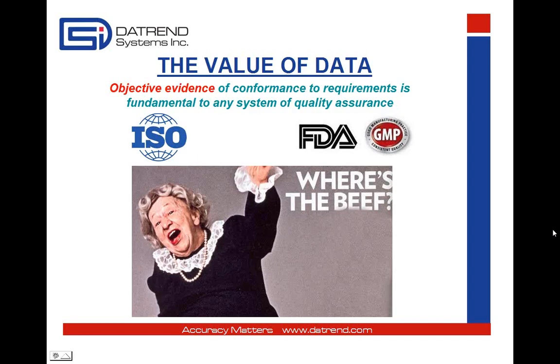The value of saving records of inspection and test data is controversial. Some hospitals follow the practice of exception-based reporting. This is where all the observations seen during a PM are reduced to one or two summarizing codes, and the detailed PM results are discarded. It's a way of coping with limitations of some systems where the service history has to be input manually from paper records. With automation, limitations around handling and storage of data are not an issue, but that's not really the point.